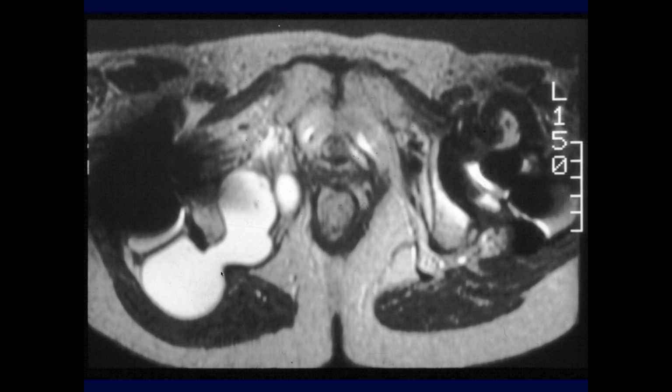This was someone who had a failed right hip prosthesis and loosening of the hardware. You can get these large fluid collections due to the instability, the chronic instability and irritation of the tissues. So this is one sign that you've got to be very concerned that you're having a hardware failure when you see big fluid collections like this. Okay.